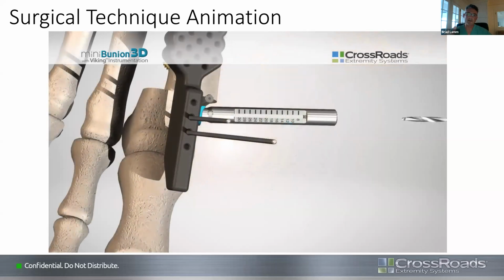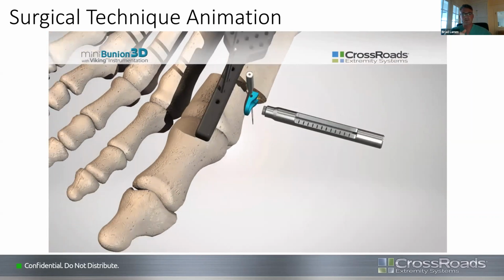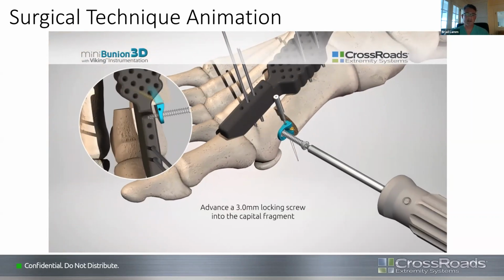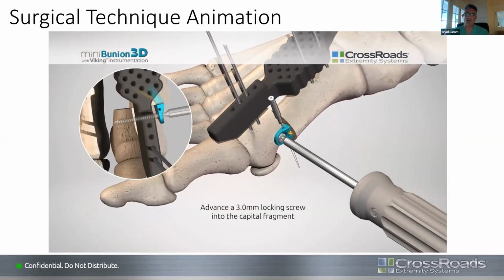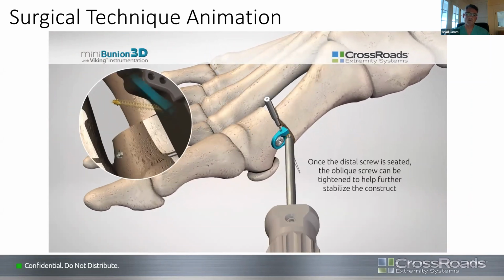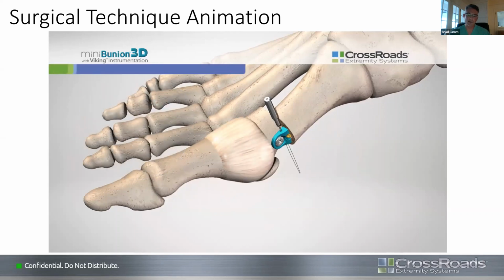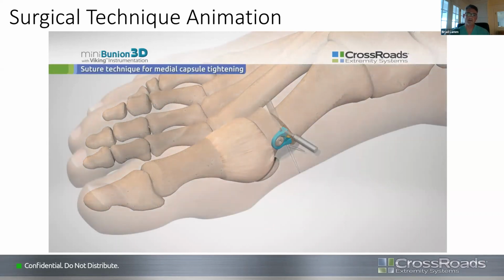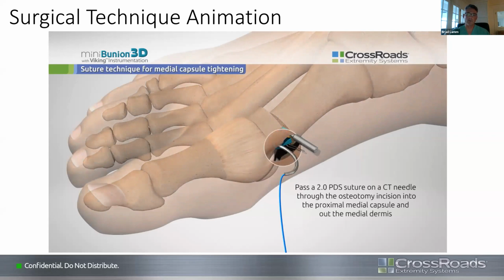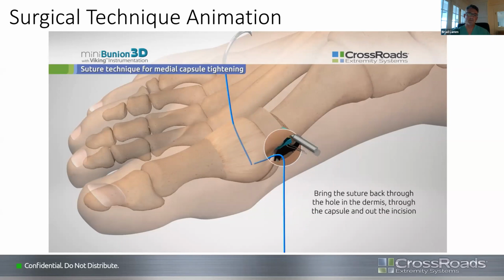Then when you have the Viking device inserted as shown, you can lock in your distal locking screw through your intramedullary mini-bunion device, usually around a 20 length screw. I usually like bicortical in this case. Remove your block off the top, and then a little bit extra tightening on that oblique screw to get a little bit more compression. This is the kind of percutaneous capsular repair.